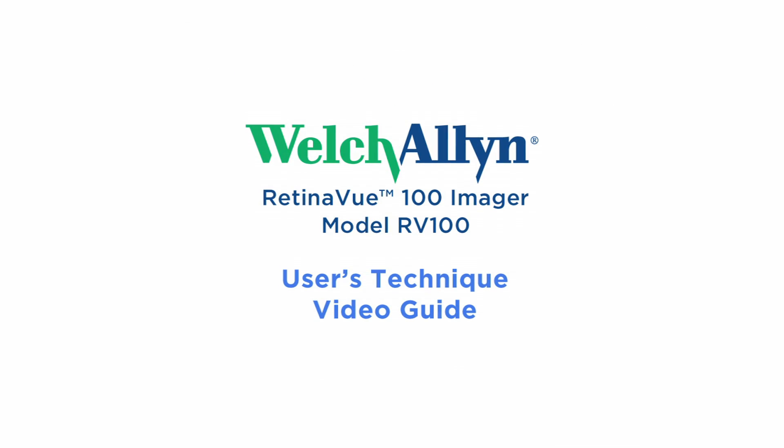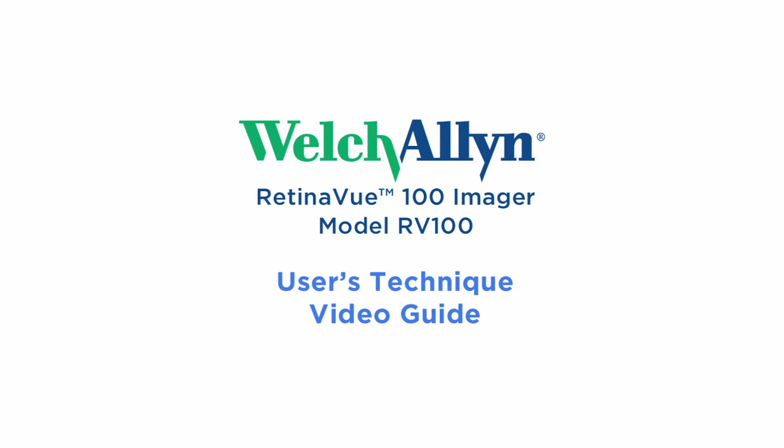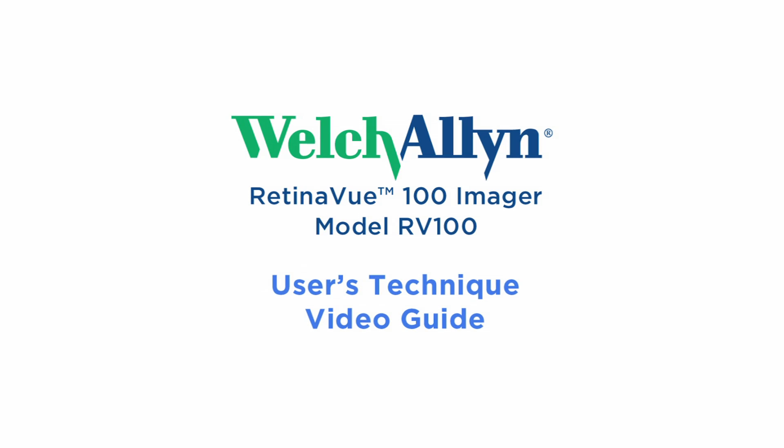Welcome to the Welch Allyn RetinaVue RV100 Imager User's Technique Video Guide. This video guide will demonstrate the proper techniques to quickly and accurately acquire fundus images.